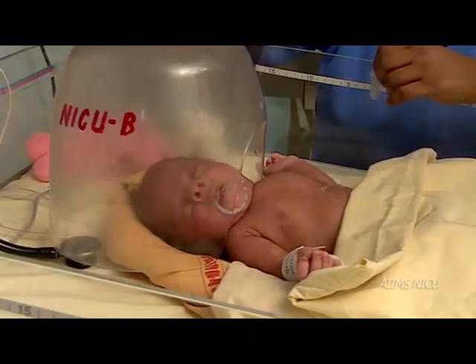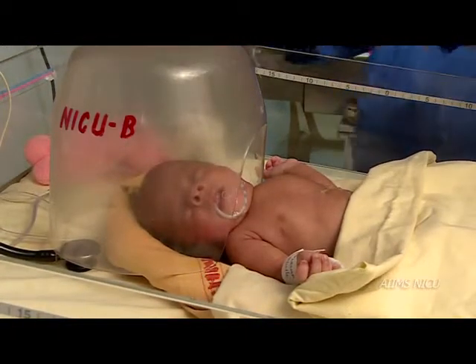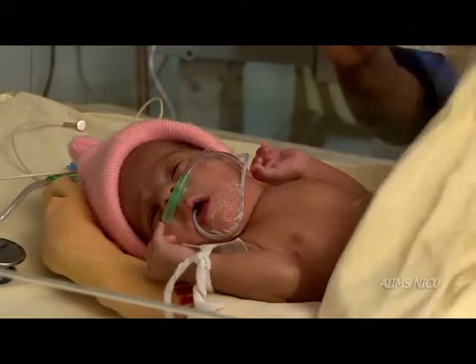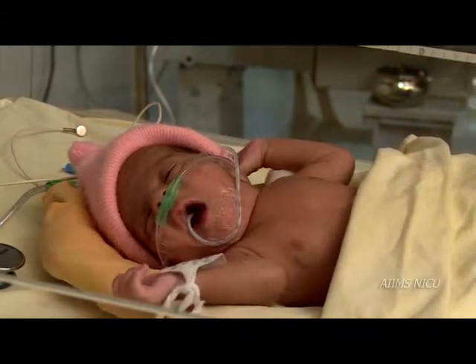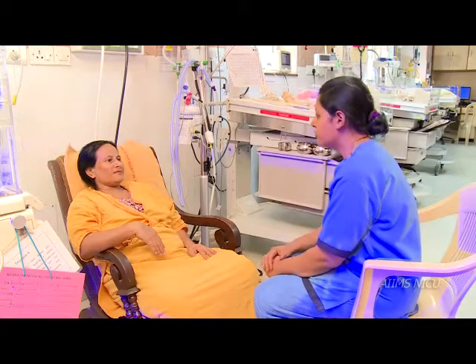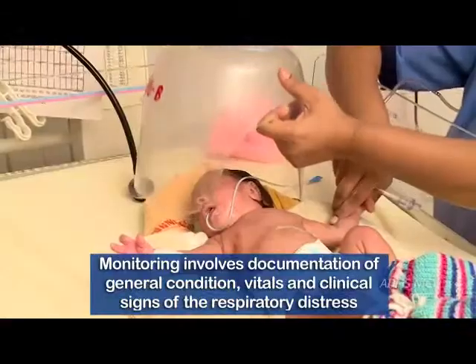In this video, we shall learn how to monitor a newborn baby who is on oxygen therapy. The overall goal of monitoring is to achieve adequate oxygenation using the lowest concentration of inspired oxygen. Counsel parents about the overall condition of the newborn baby and always ensure asepsis while monitoring.